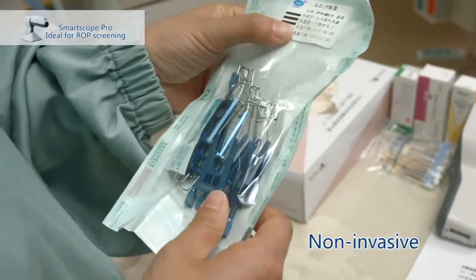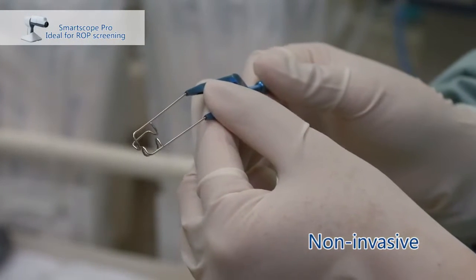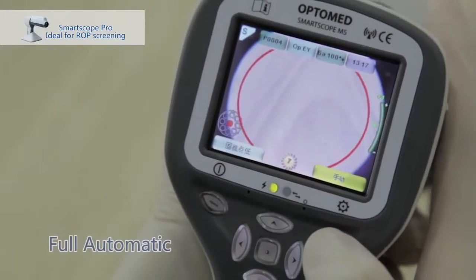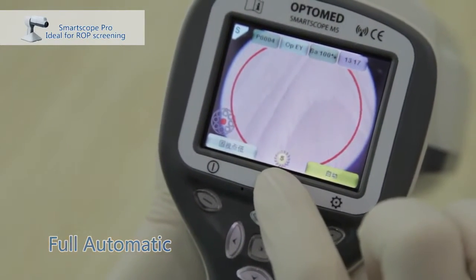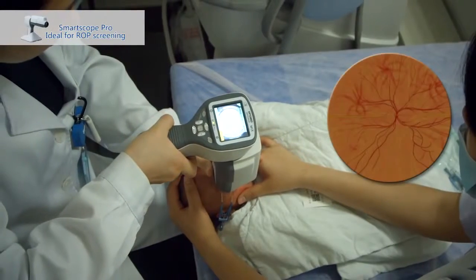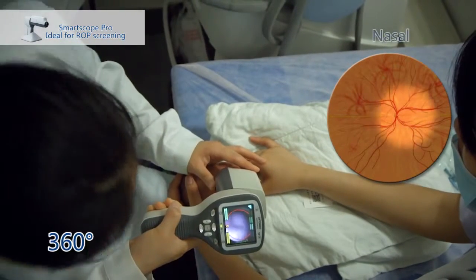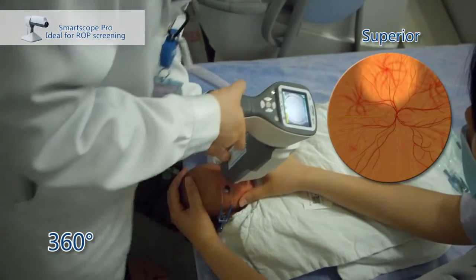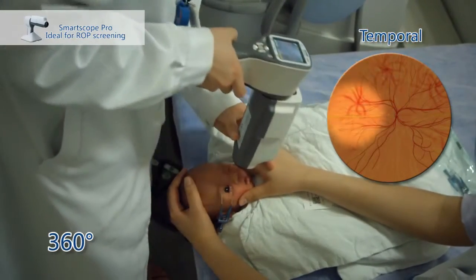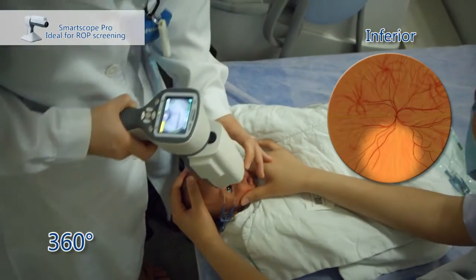Use a lid speculum to widen the baby's eyelid for adequate screening of the fundus. Choose auto mode. Set exposure value to 4 or 5. Approach baby's eye vertically. Capture a posterior image. Adjust the direction to capture the peripheral images at nasal, superior, temporal, and inferior area respectively.